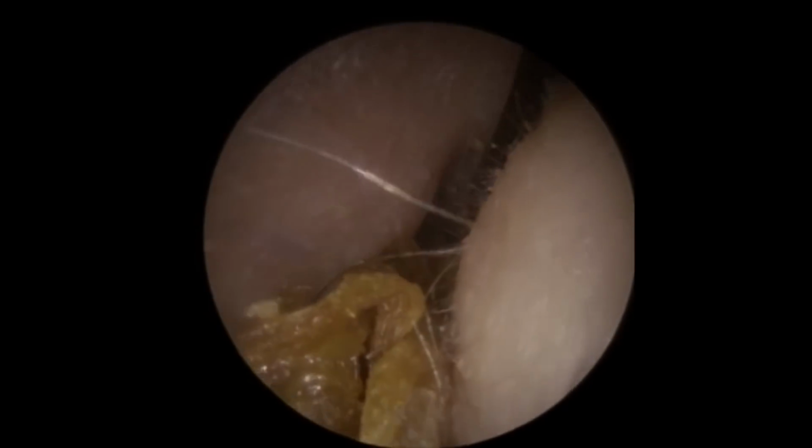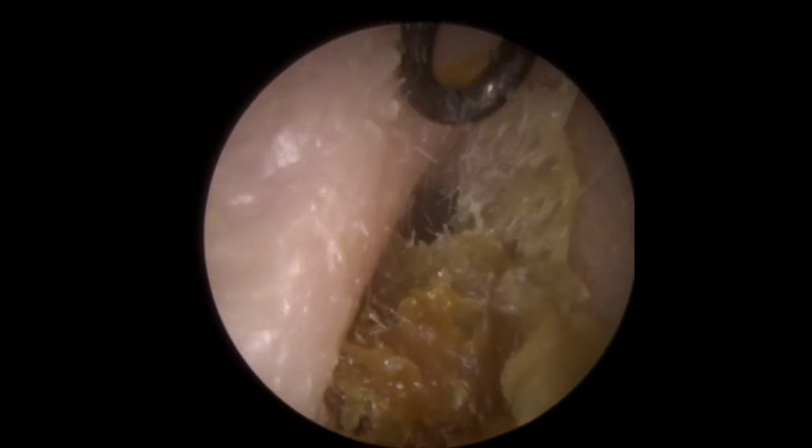Now it's starting to fold over again, you can see there, look. So it's starting to roll, so it means there's a little bit more still attached further in. So just get behind that so you can see the whole thing lifted, but you can see there's almost a tail of wax still entering the canal there. So we've got a little bit more to go behind now. A little bit of dry skin there to the right side, which hasn't helped. You can see it's actually fallen out of the ear there, so just bring it back up. You can see how long that piece is there, just trying to get a grip on it.